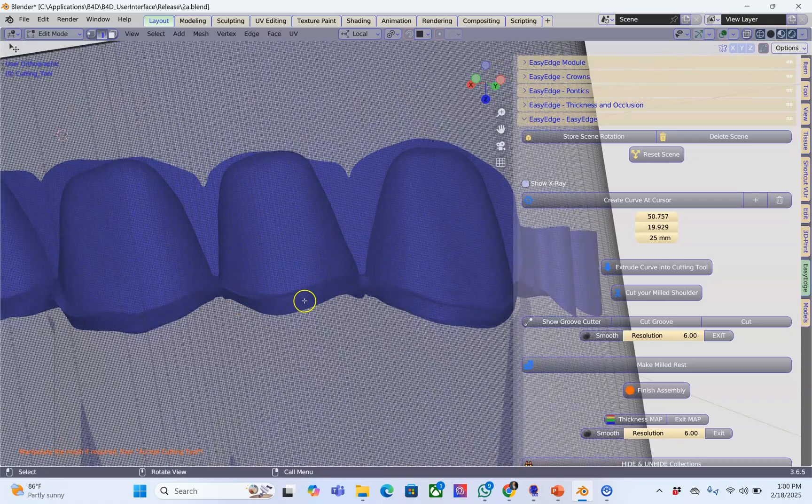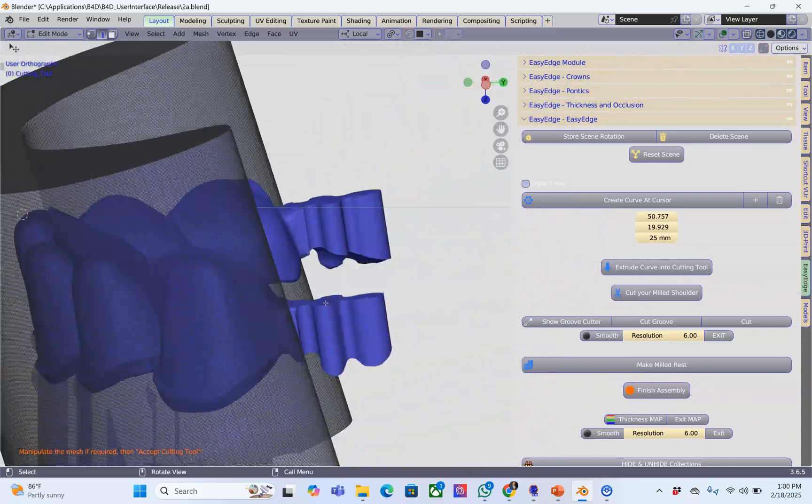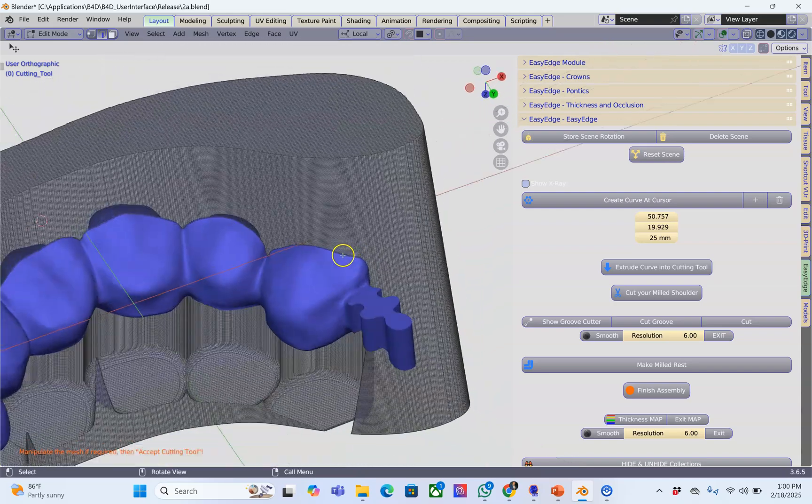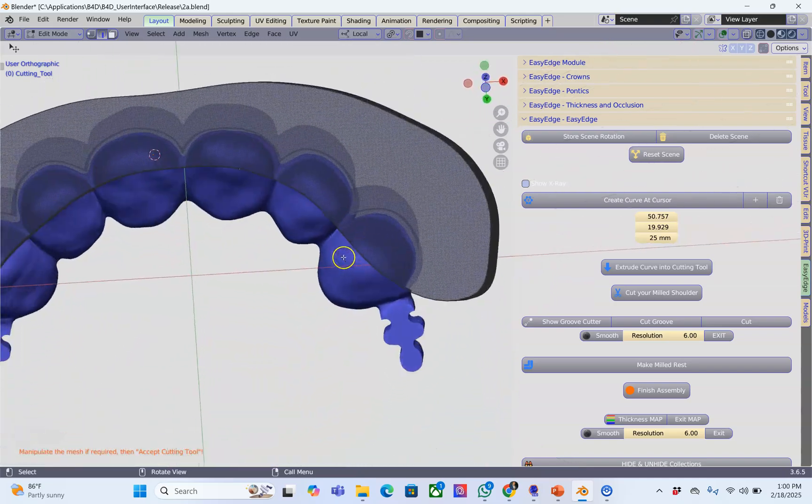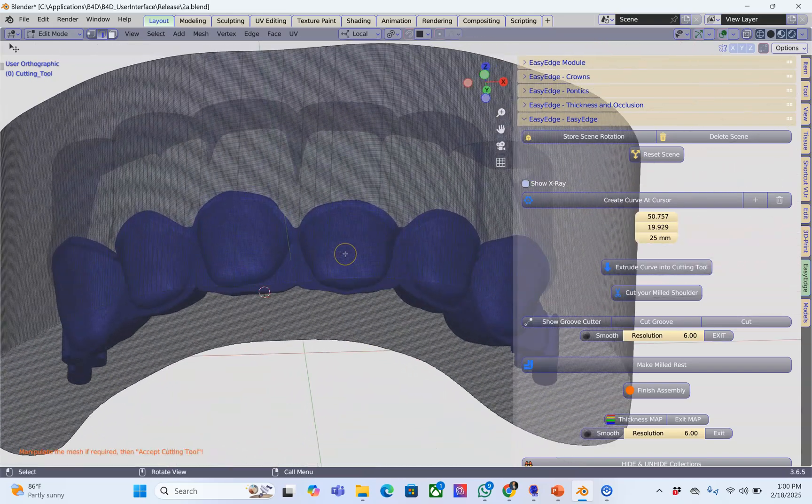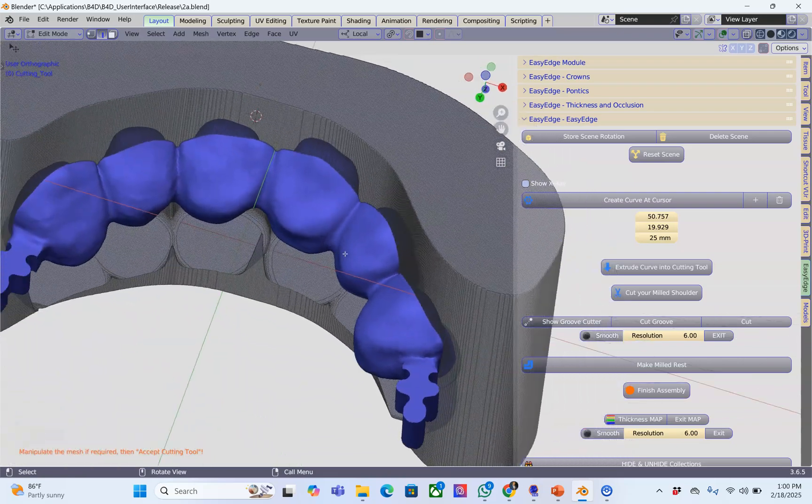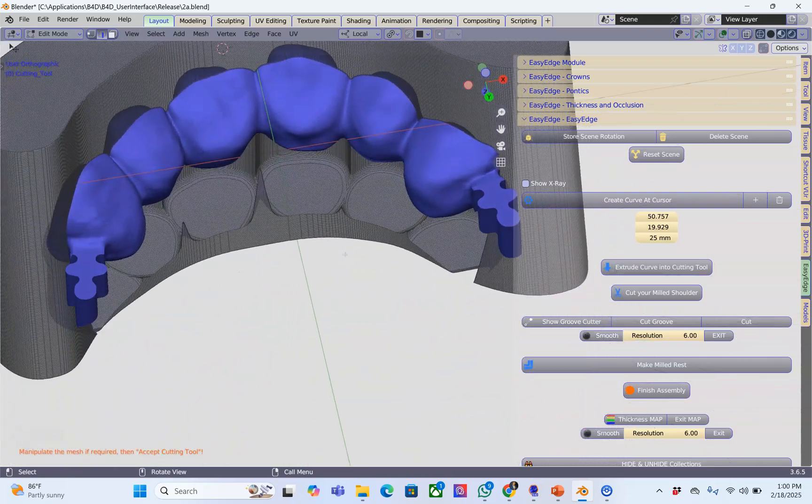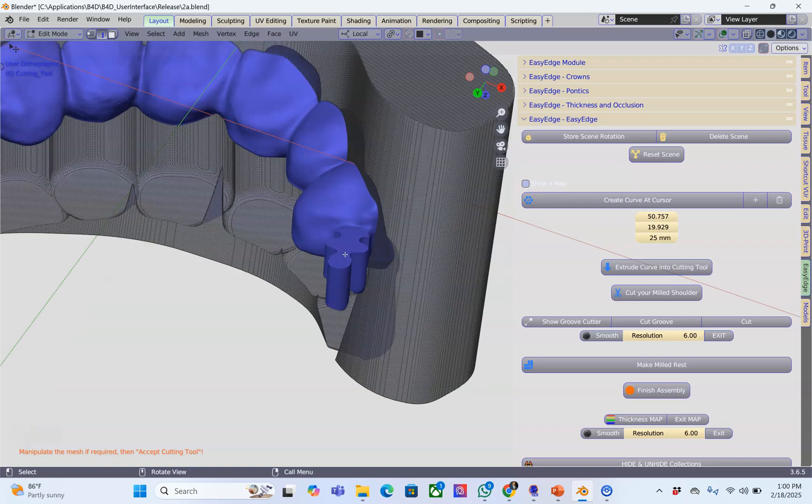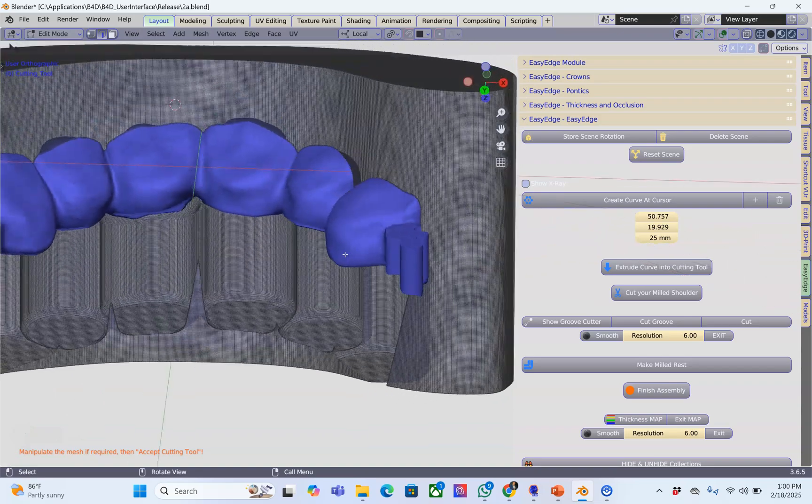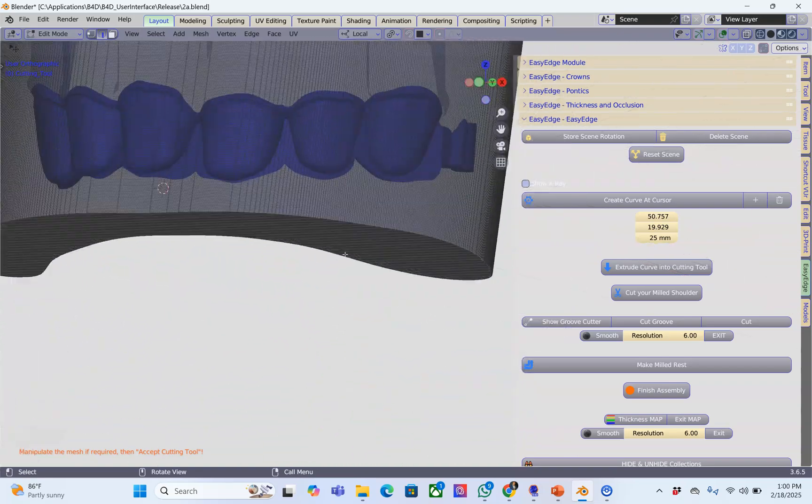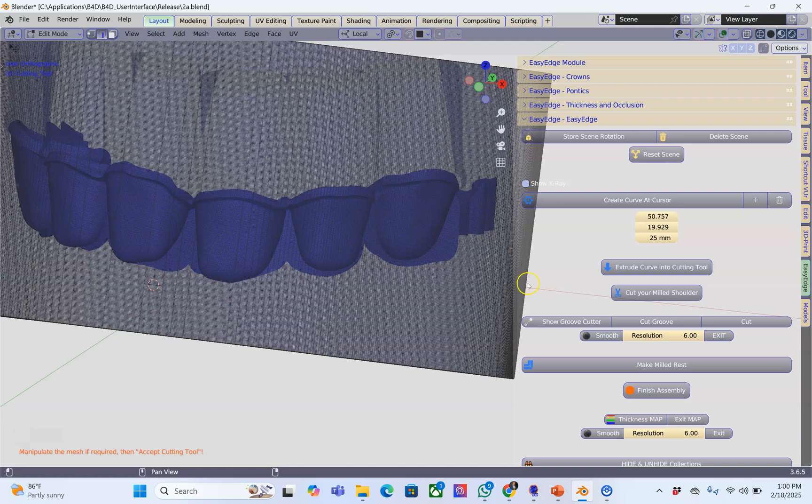Now assuming this is milled out of zirconia and the other side is milled out of an Emax or something. This was super easy. Now what we're going to do is commit to this. I'm going to cut the milled shoulder.